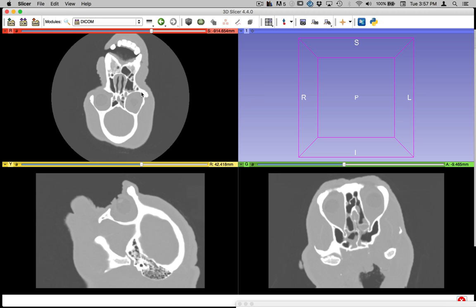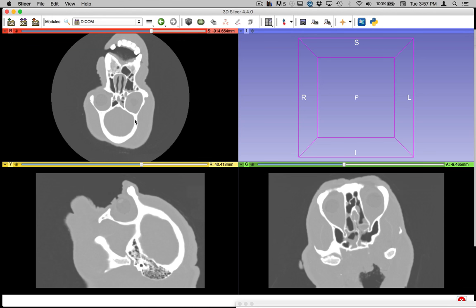Now luckily, we're just dealing with two fairly extreme densities between soft tissue of just the outer skin and the bone, which is the densest tissue. So it's actually quite easy to separate. If you need to separate out something like kidney or liver, then the differences with surrounding organs is much more subtle and difficult to extract.